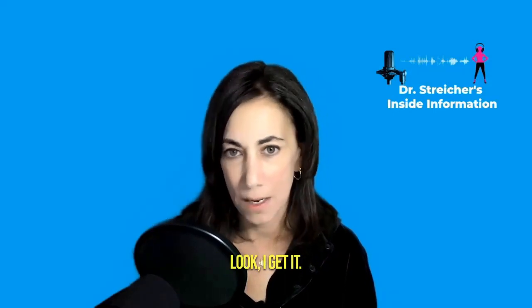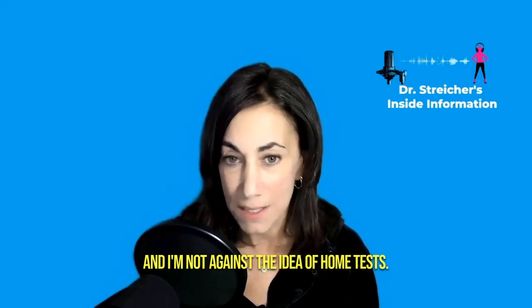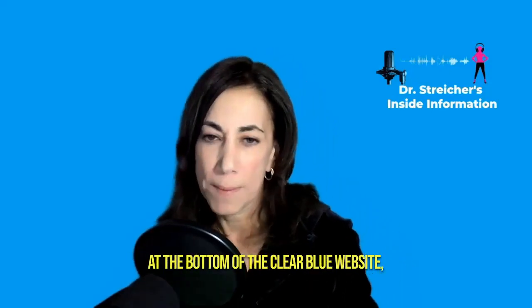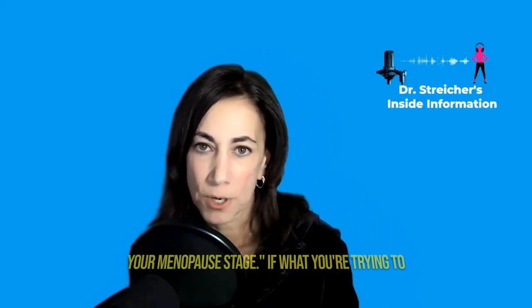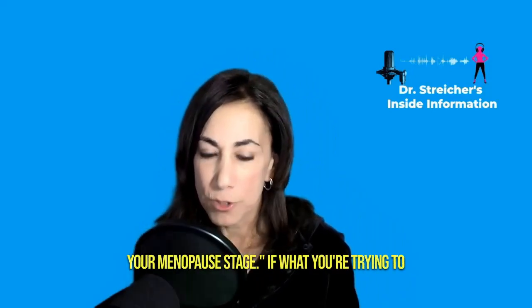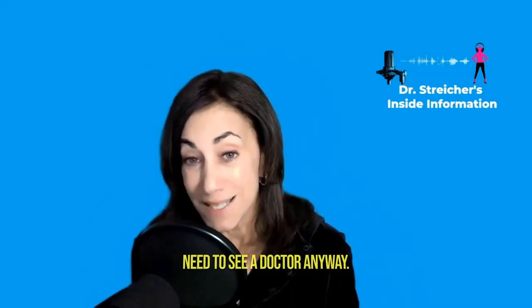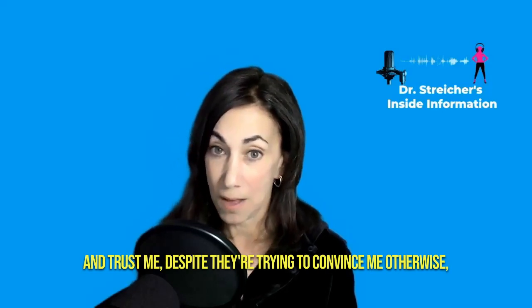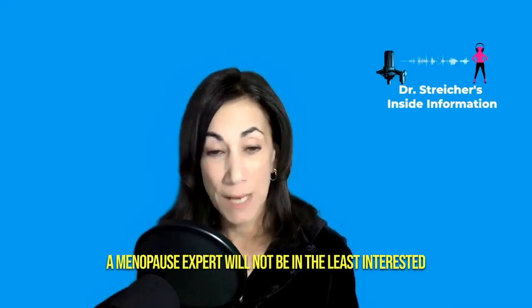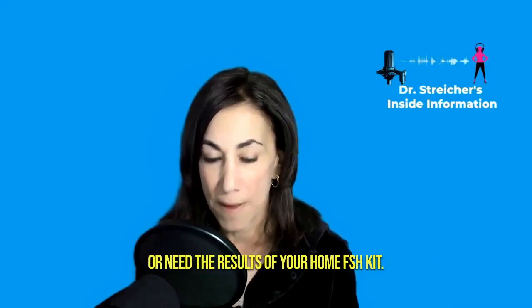Look, I get it. Women are looking for information and their doctors aren't helping them. And I'm not against the idea of home tests. At the bottom of the Clearblue website, they state, "Only a healthcare professional can confirm your menopause stage." If what you're trying to do is avoid going to a doctor, according to the Clearblue people, you need to see a doctor anyway. And trust me, despite their trying to convince me otherwise, a menopause expert will not be in the least interested in or need the results of your home FSH kit.